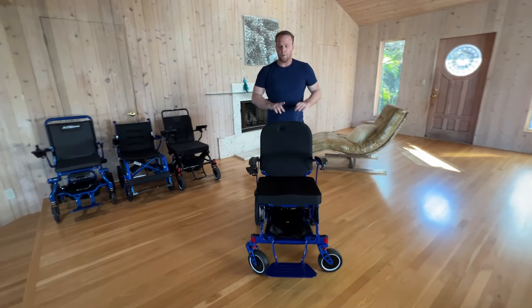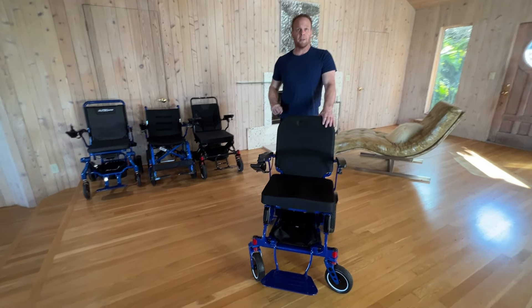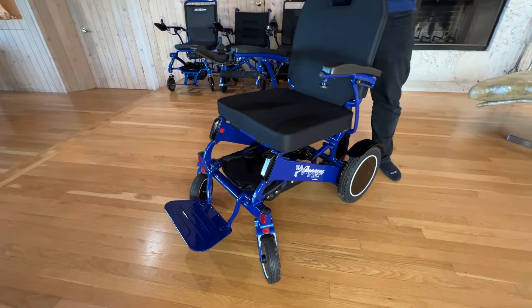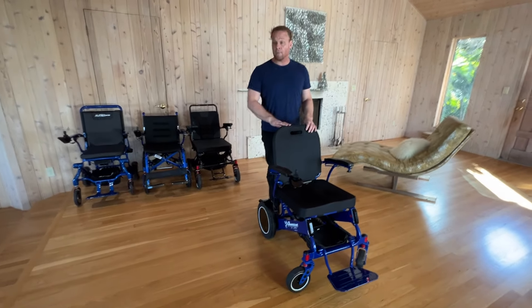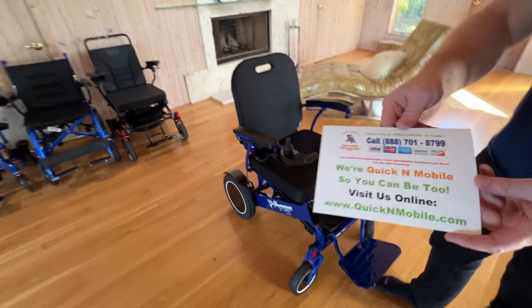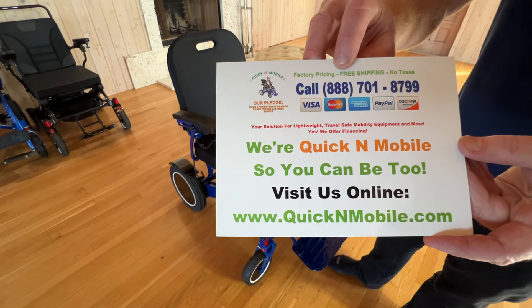I'm certain you might want to figure out where to find this chair that passed the indoor gauntlet with flying colors. Does it maneuver in a kitchen? Yes. Does it turn in tight spaces? Yes. Does it have great grip on the tires? Yes. Does it have flat-free tires? Yes. Can it be pushed up a ramp used for trucks? Yes. Can it go down a ramp it's not supposed to without crashing? Yes, it can. You can find this chair on quickandmobile.com or you can call. Thank you so much for watching.